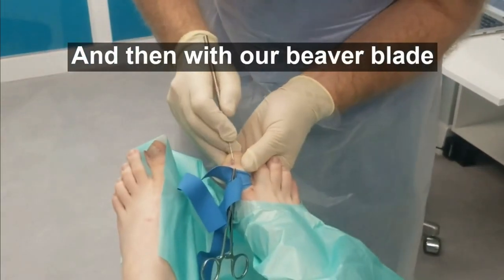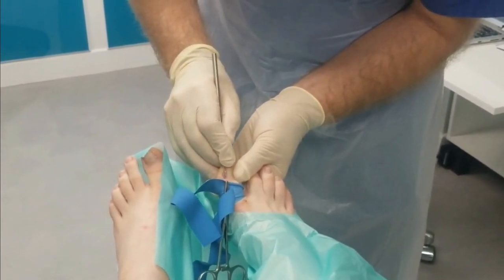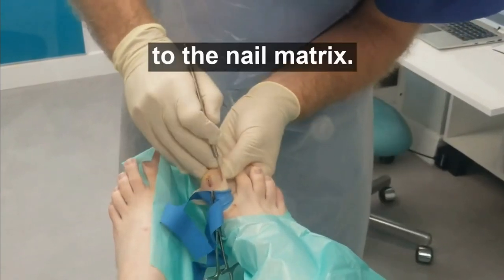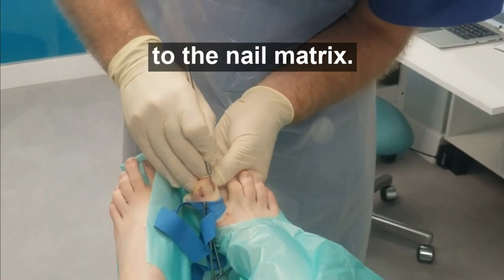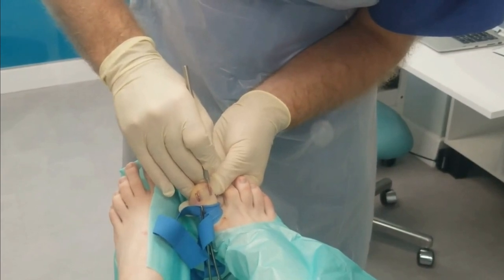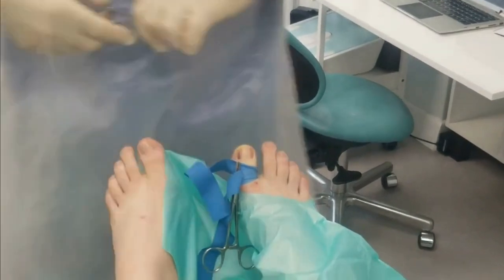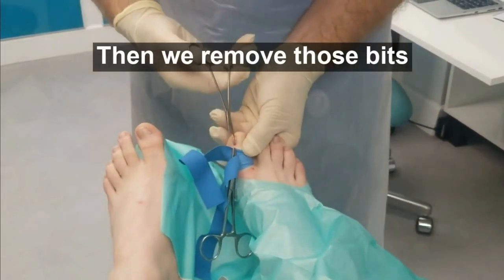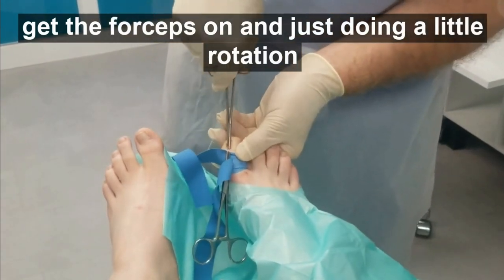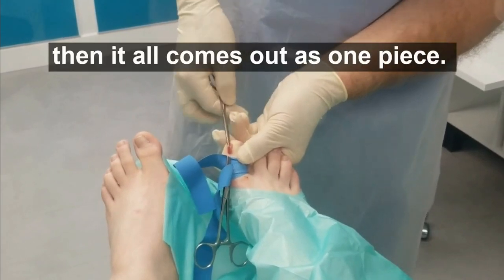Then with our beaver blade, pushing all the way through to the nail matrix. Then we remove those bits — getting the forceps on and doing a little rotation. If it's all loose, it all comes out as one piece.